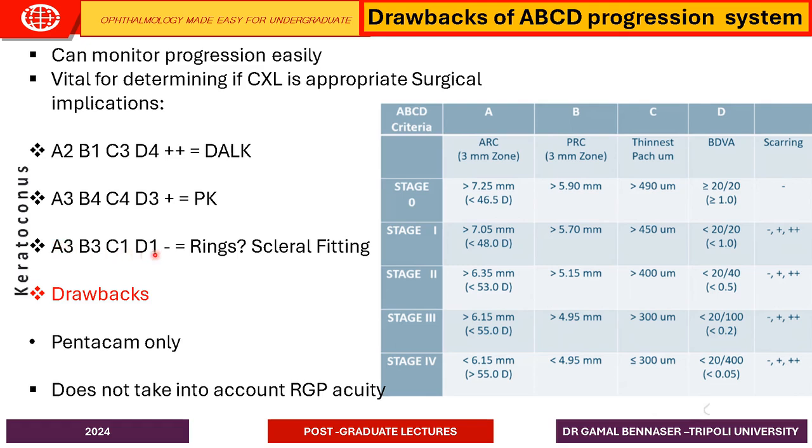And as I said before, the drawback of this ABC system is that it is dependent only on the Pentacam, and it doesn't take into consideration the best corrected visual acuity using rigid gas permeable lenses.